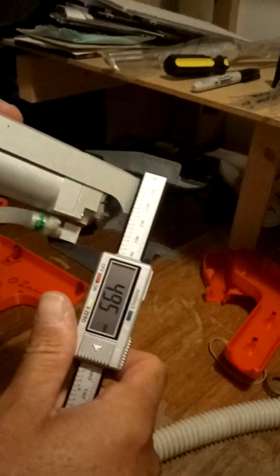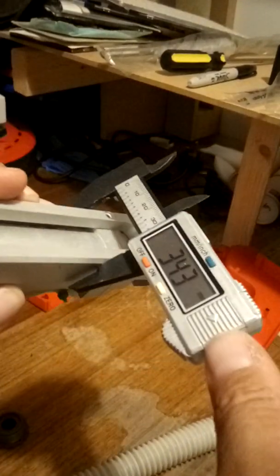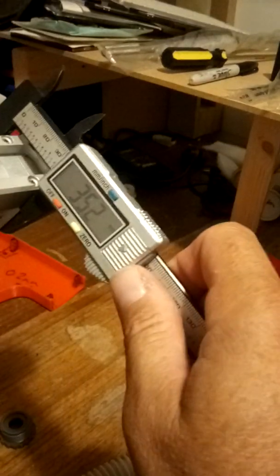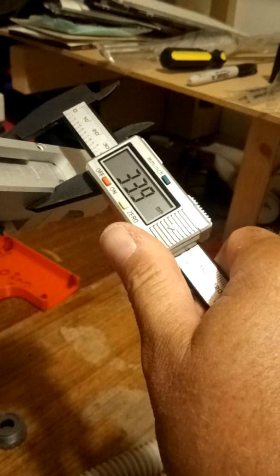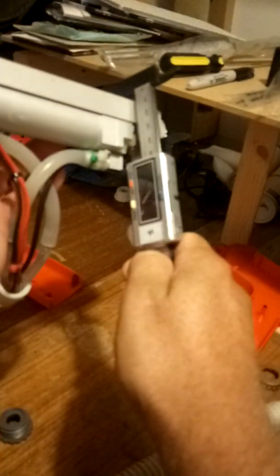That's 49. Across the top is 34. I'm going to say 35, just to give it a bit of play. We call it 35, like that. That's 37 mil. That 51. So 51 is going to be really tight. 51.